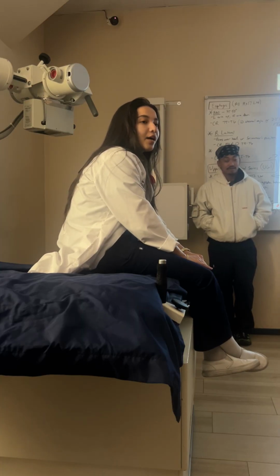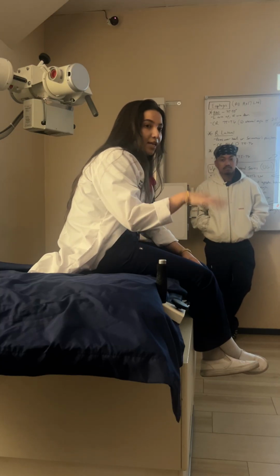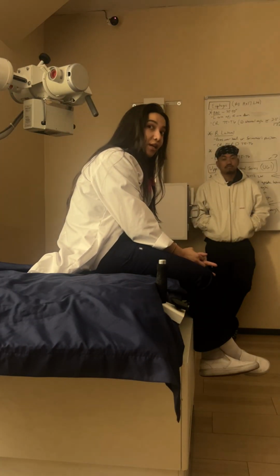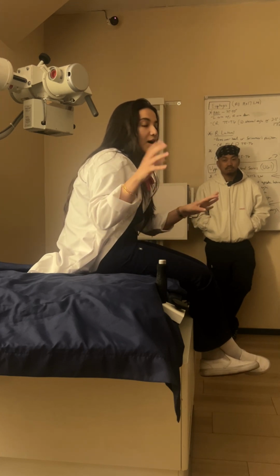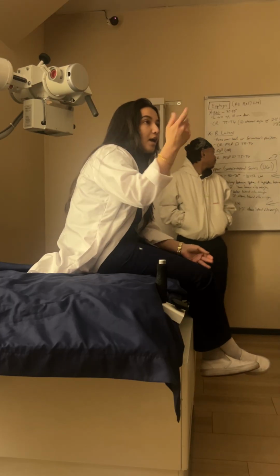And then I get them into the bathroom. They change out, they come back to the table. I take my scouts, and then I turn them into position. I call the doctor. He comes in, he explains the procedure to the patient again, and then he begins, and then he's telling me what to do. And then he's telling me, drop it, and then he's going to leave.